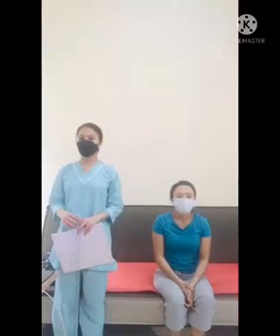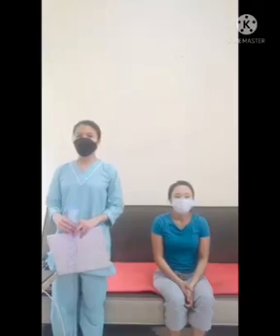The next projection that we're going to do is the infero-superior axial projection, Clements modification. The patient is dapat po nakahiga po yung patient natin. Imagine na lang po na ito po yung sandbag na gamit-gamit po natin sa radiographic. The image receptor po natin is 8 by 12, with our secondary marker and the meter stick.